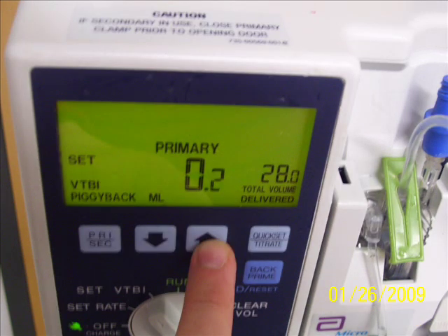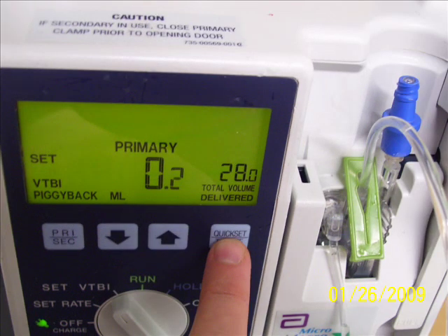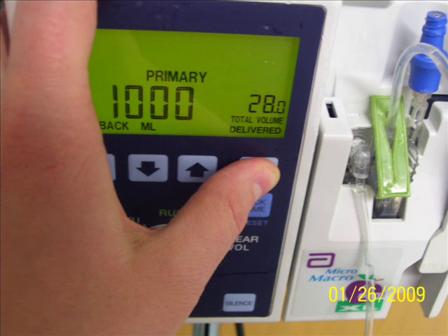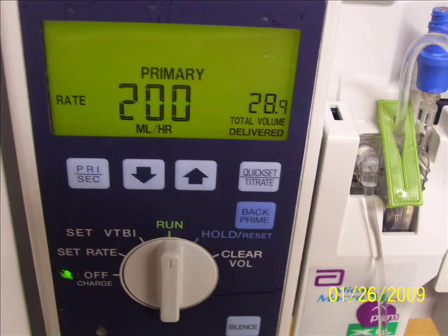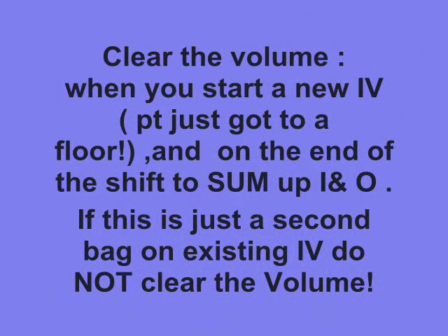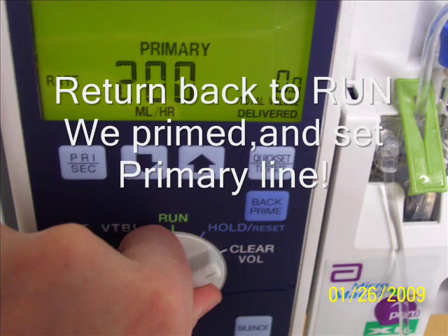Again we can use the arrow or the quick-set to change the numbers for how many milliliters, because this pump works in milliliters. How many milliliters is in our bag is in our order that we need to give to the patient, so that's what we are setting right now. We will put a thousand for our primary infusion. But we forgot to clear the volume — before we start any new IVs, we should clear the volume. So we are turning the cassette to the right side, and as you can see the total volume delivered is now zero, which means we cleared the volume.